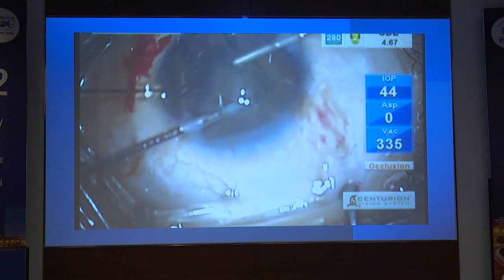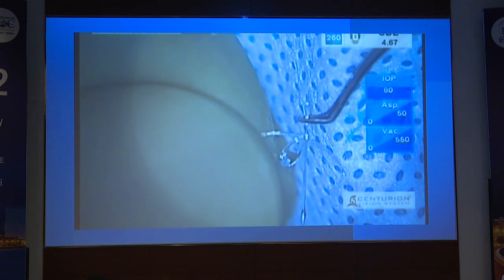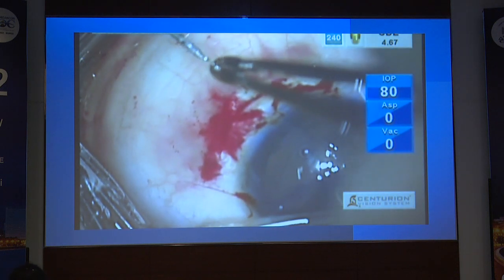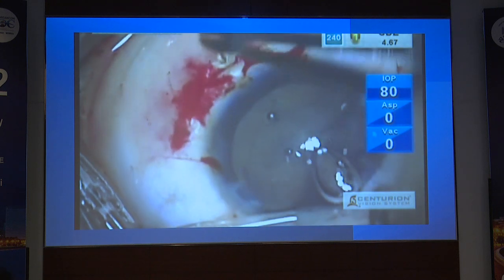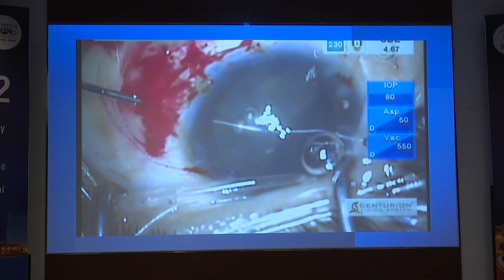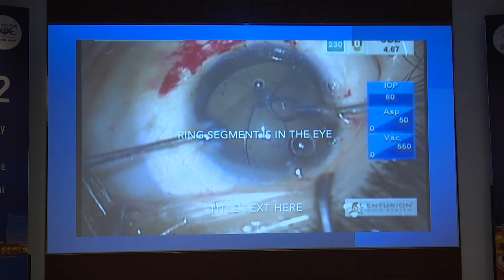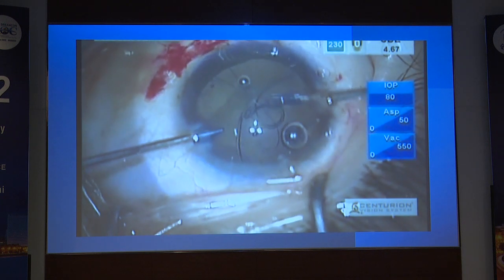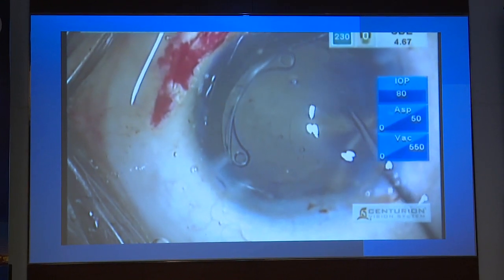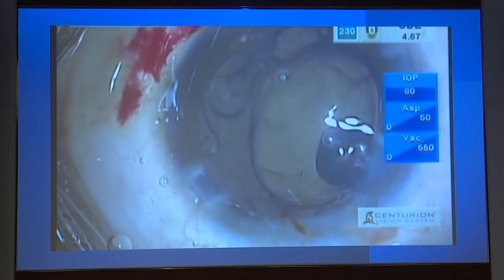With capsular hooks, this is the main advantage. After doing a femtosecond laser capsulorhexis, we then pass one needle of a double-armed prolene through a capsular ring segment. Railroad this needle out of the eye and then railroad the second needle 3 mm away from the first one, making sure not to nick the capsule. Position this ring segment after railroading the second suture and then put it in the eye. Tension the ring segment by suturing the two ends and follow it up with a 12 mm capsular tension ring to stabilize the bag in its entirety and then inject the lens.